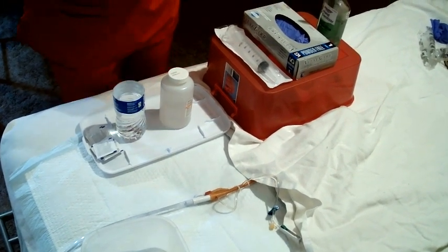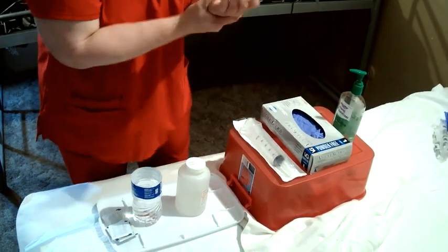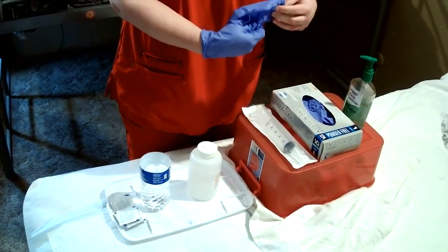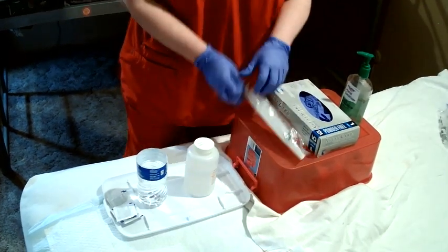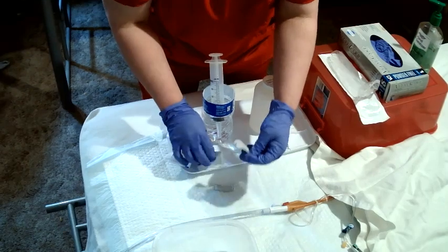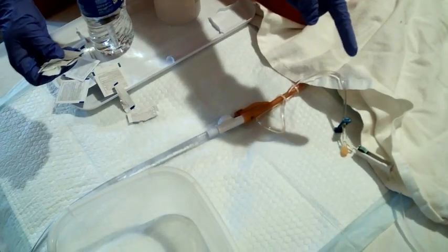Yes, just help. Okay, I'm going to do hand hygiene again because I was touching everything. So what I'm going to do is use some sterile saline and a syringe to push the clot out of the way. Again, is that still okay with you? Yes, just help. I usually open a couple just to make sure that I'm prepared just in case. All right, so you're going to double check — make sure you do have your Foley, three-way Foley clamped.